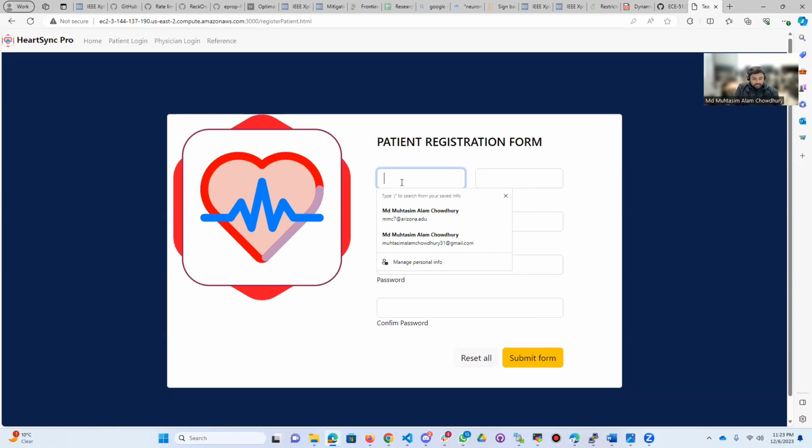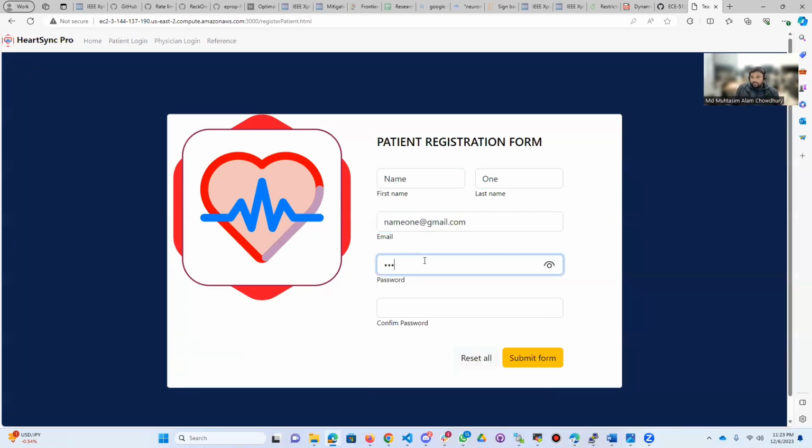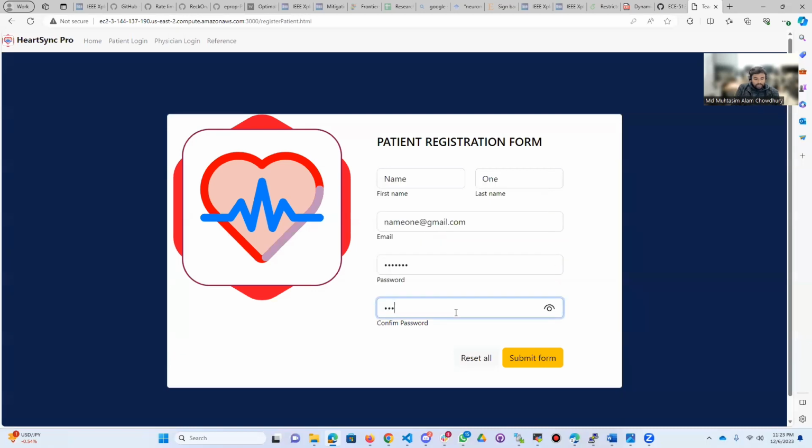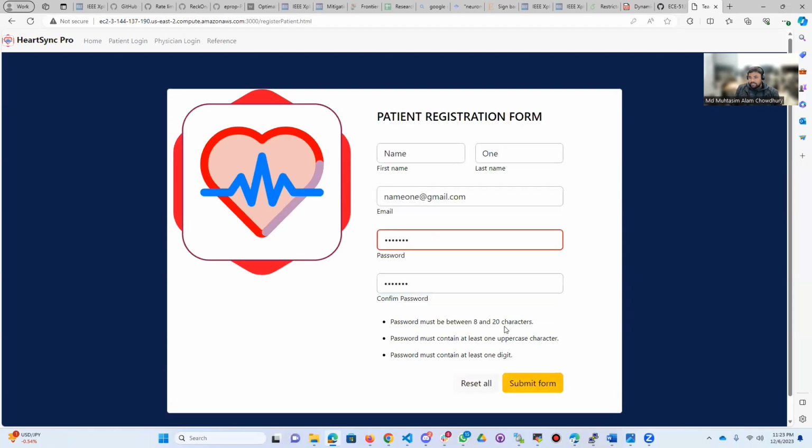Just enter a name, and an email, say name1@gmail.com. Without the at sign and the gmail.com, it won't work. Say we save a password like name1. Submit shows that there are some points to review, as we have to provide a strong password. So let's try name1 again.